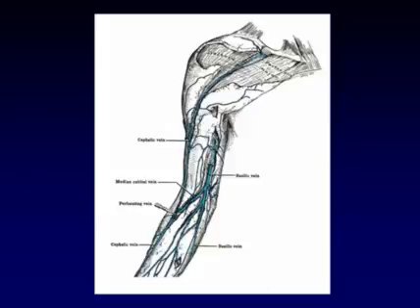The thrombosis of the cephalic vein is really, for the most part, a clinical diagnosis. If there's a thrombus there, you can probably see it. And better yet, you can even feel it as a ropey area of thrombosis on the lateral side of the arm. This is that vessel that you see in well-muscled people along the biceps muscle laterally. So we don't tend to include that in our normal examination.